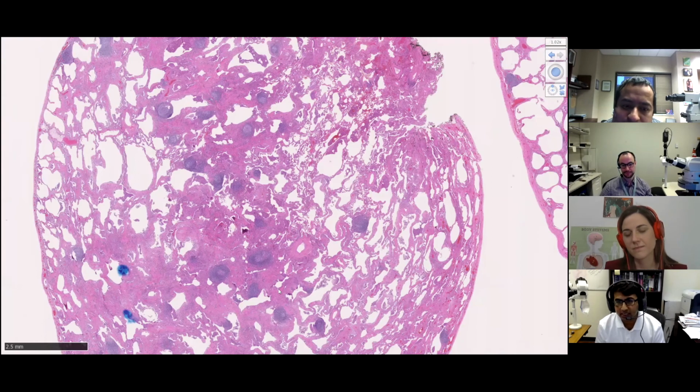We raised the concern for a connective tissue disease related interstitial lung disease, even though some areas looked like NSIP. But there were also smoker's macrophages, and some of those areas had a ropey quality to the collagen. We noted in the comments that, especially in the upper lobe, this might be smoking-related fibrosis. That's where we left the report.